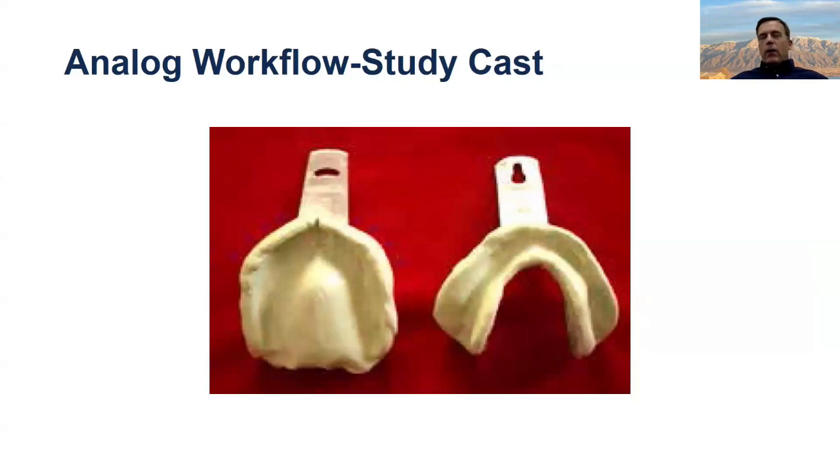So we've talked a little bit about the theory of dentures, or how you might do a denture case. So let's focus on how we do an analog case. I don't think this will be news to most people. I'll flip through it, but this is, I would say, the baseline. And as we're talking about digital dentures, we'll compare and contrast the digital workflow with analog dentures. As you know, the first step in doing a denture case is a preliminary impression.